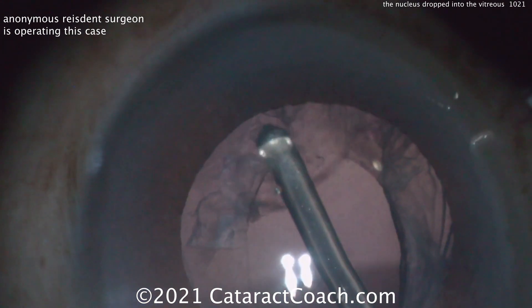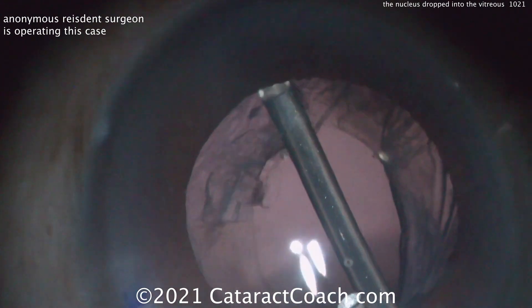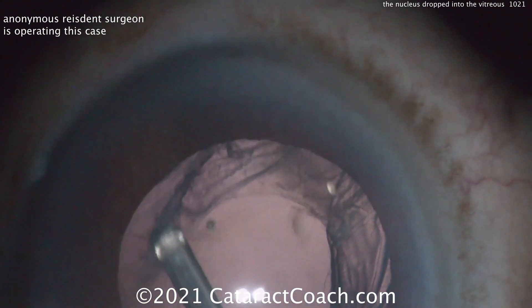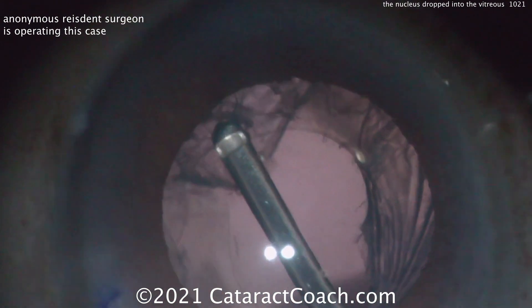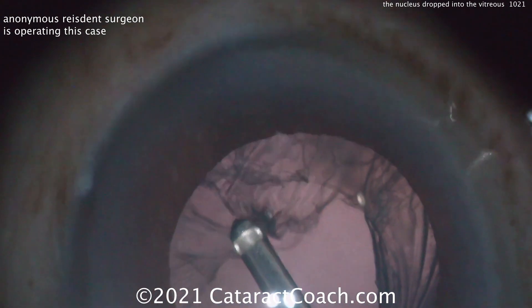To remove cortex without damaging the capsule, if you've already removed the prolapsed vitreous, you can just tap the cortex button on your machine. It'll be position one irrigation, position two aspiration — it won't go to the cutter. That's a good technique here for removing that cortex. You definitely want to clean the cortex up; don't leave it behind.